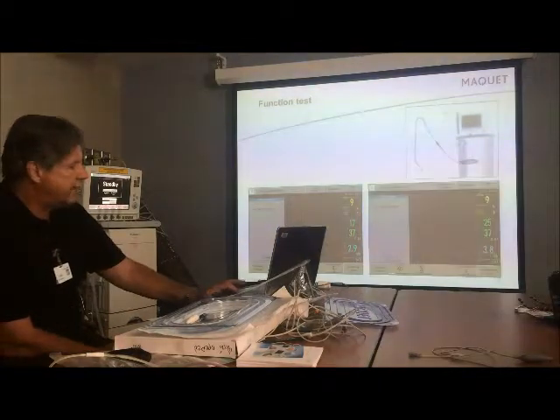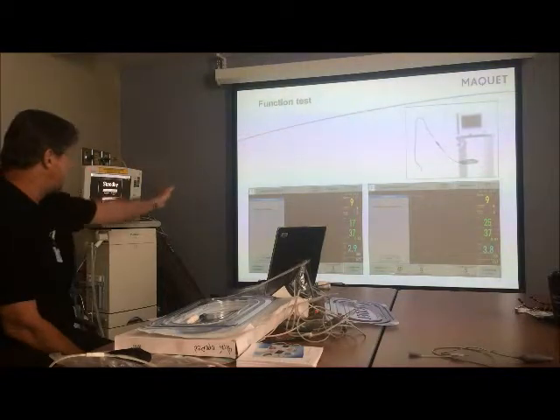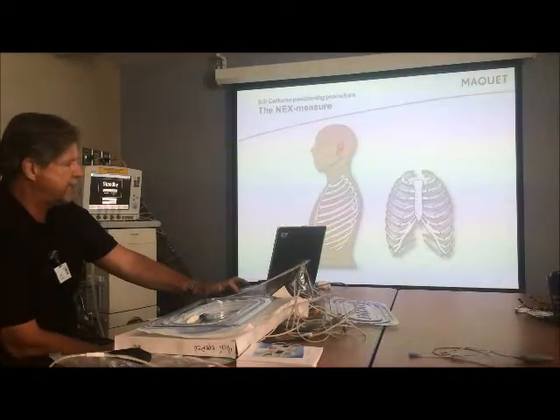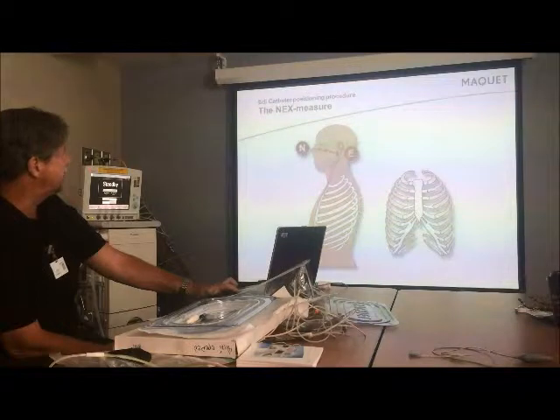So we test it, and like I said, you can do it when it's running. When it's running, the little message will be on the side of the screen rather than the middle like it was just then. So here's the schematic of what we measure: the nose to the ear to the xiphoid process, calling that the NEX measurement.